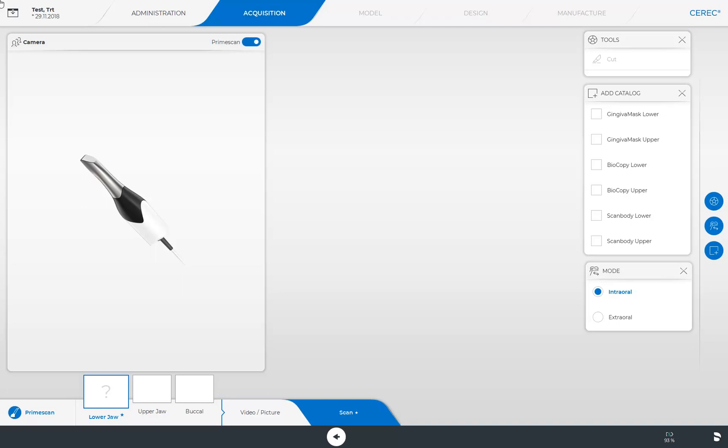Below the list of image catalogs, you will see outlined which can be added. As we have selected the biogeneric individual design mode and a restoration in the lower jaw in the administration phase, three image catalogs are displayed at the lower edge of the screen. The lower jaw image catalog, which is marked in blue and therefore active, also displays a question mark. This indicates that this is a mandatory scan. Next to it, you find the upper jaw and the buccal bite image catalogs.